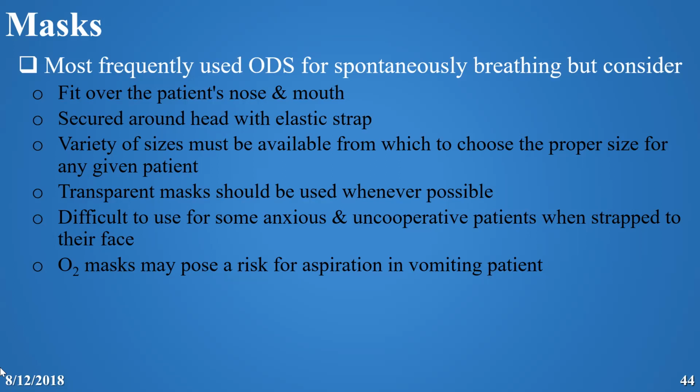And sometimes it's very difficult to use in a very anxious and uncooperative crying child, especially when you strap it on the face. When we use a mask, there is always risk of aspiration because the child can vomit.